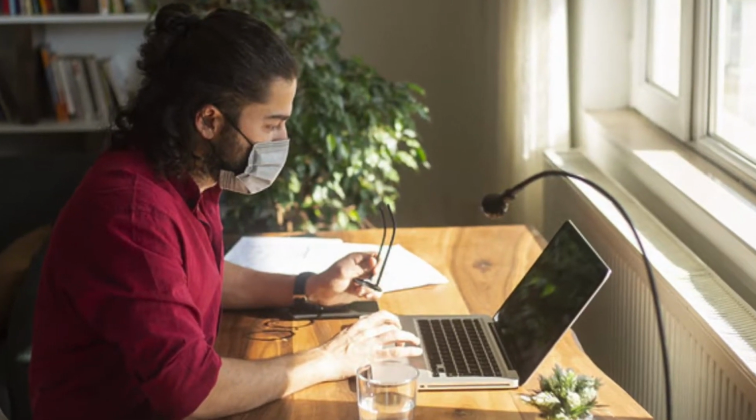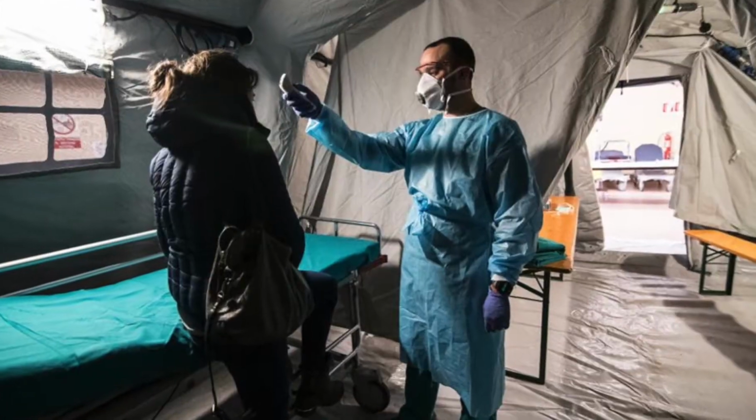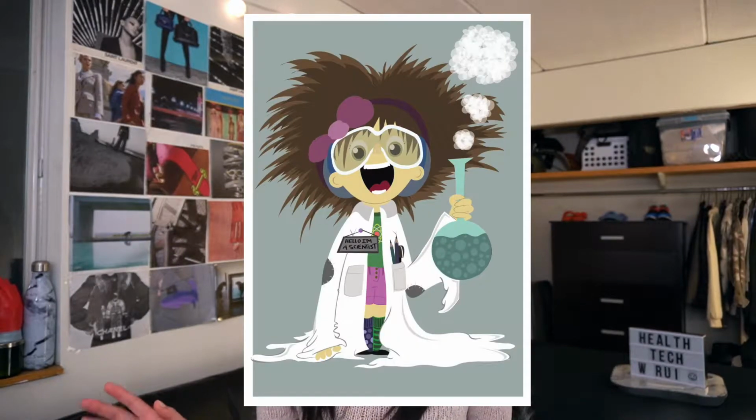So it'll really depend on your test results in regards to what they'll advise you to do. Maybe they'll tell you to keep self-quarantining, maybe they'll tell you to seek further medical assistance and give you the resources for that. These are all the physical steps you'll need to do to conduct the full coronavirus test, but for me, I really like understanding the science behind how things work, so I'll also dive into that a little bit.